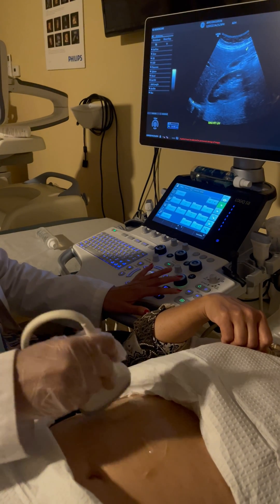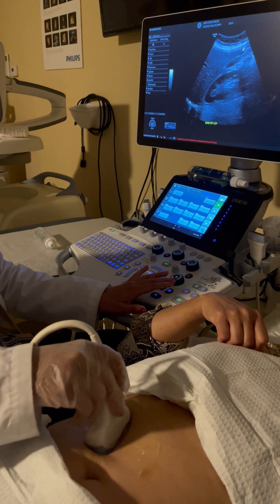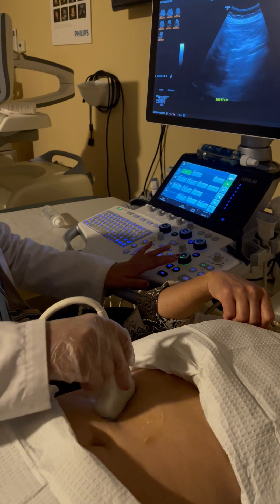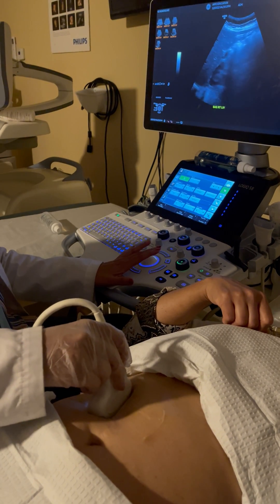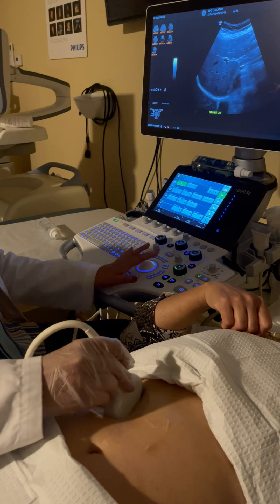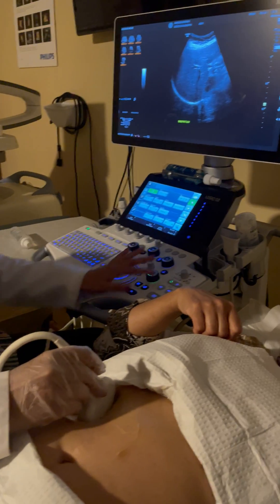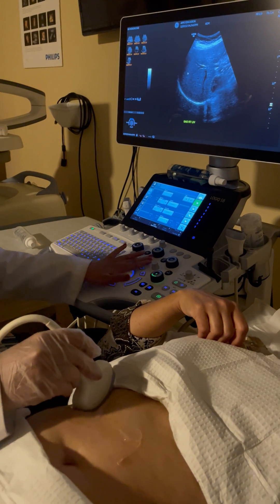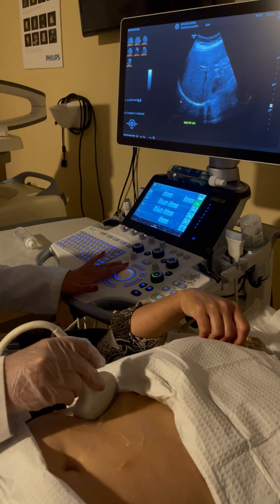The last image of the sagittal scan: I come more oblique, angling my transducer towards the patient's axilla. I increase depth and take an image of the diaphragm with the pleural space. This image shows the entire right lobe with the diaphragm and the adjacent pleural space.